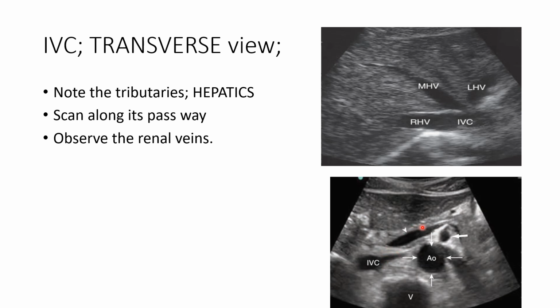Okay, so this is the portal confluence, which is formed by vessels, the splenic vein.